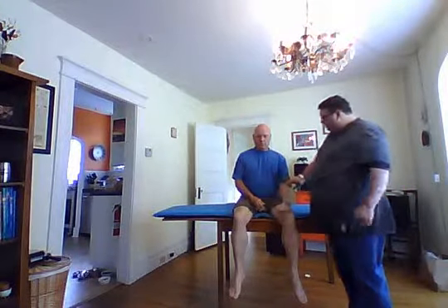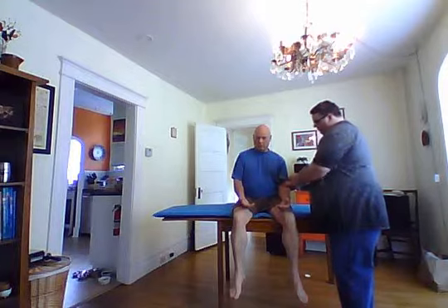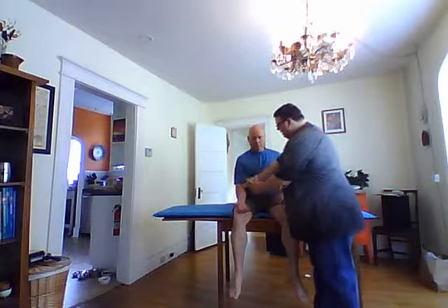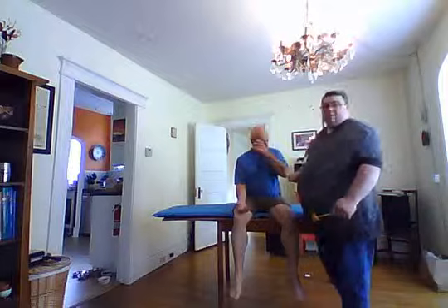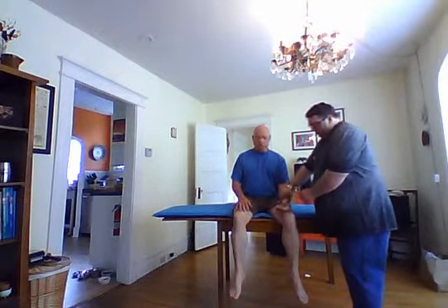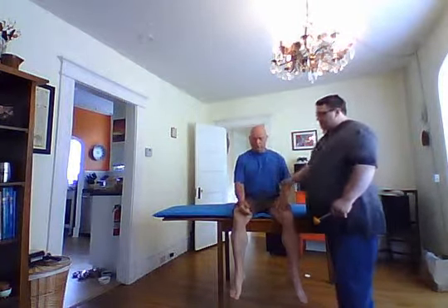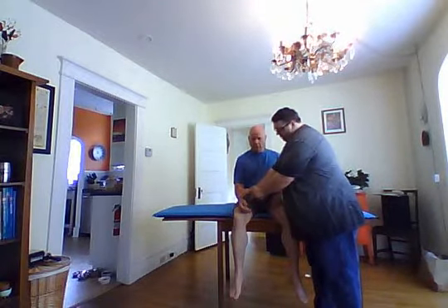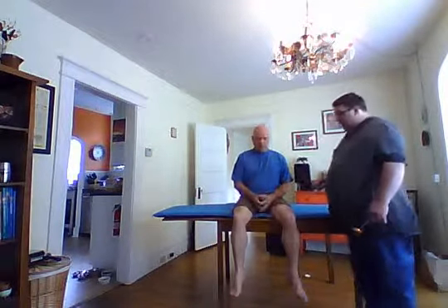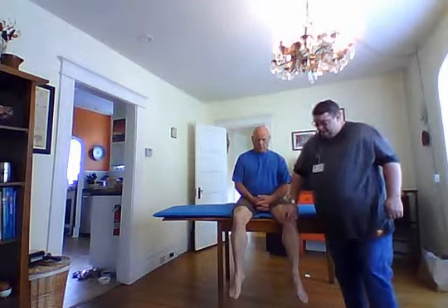Now we're going to move to reflexes. First is the bicep reflex. Find the bicep tendon, use your hammer with your fingers, strike your fingers and watch for the bicep to react. Compare side to side with an equal reaction, which I received. Now the radial nerve, just about 2 centimeters up from the wrist, strike with the hammer, you're looking for the thumb to react. Make sure you compare this on both sides and see if you get an equal reaction, which I did.